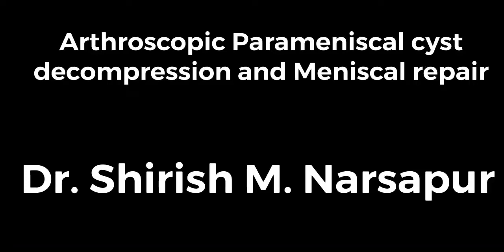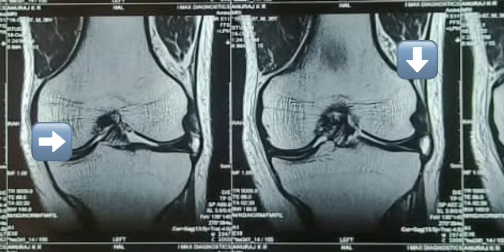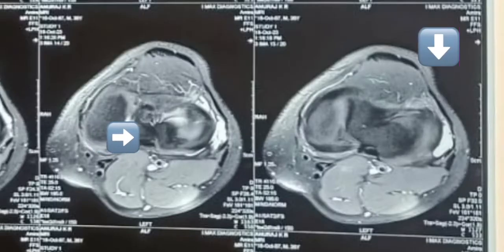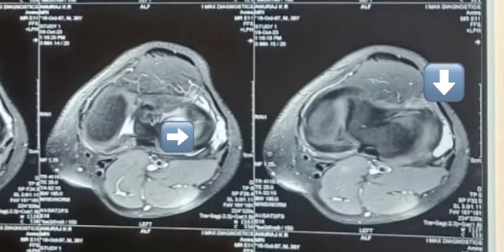This is the video demonstrating arthroscopic parameniscal cyst decompression and meniscal repair. This is a case of a 25-year-old gentleman with a parameniscal cyst due to a horizontal tear in the lateral meniscus, as can be made out from the MRI images in all the planes.